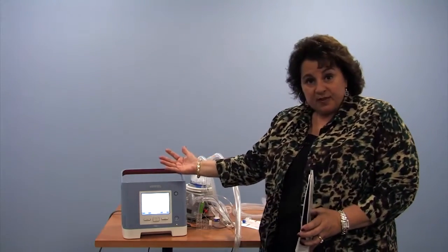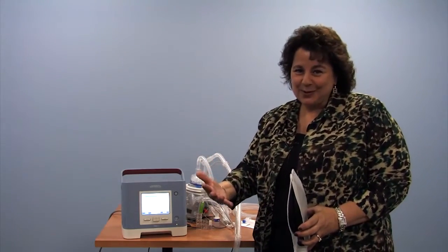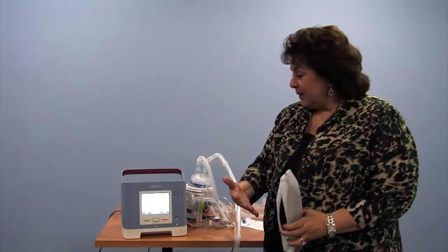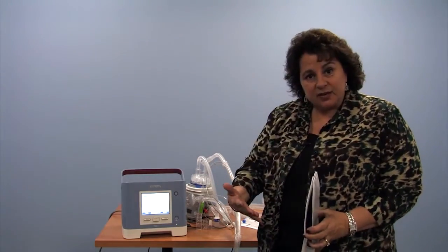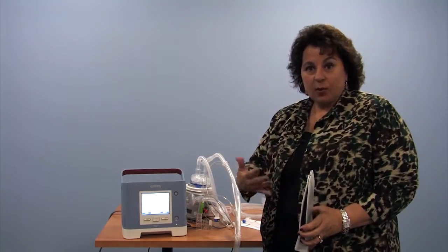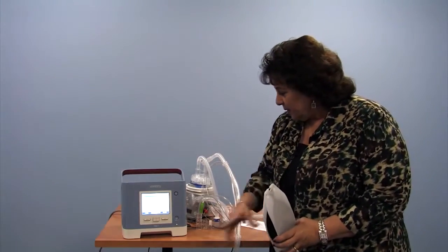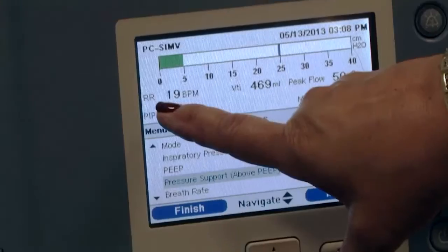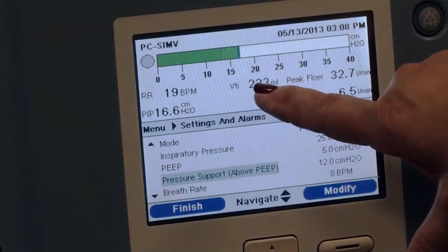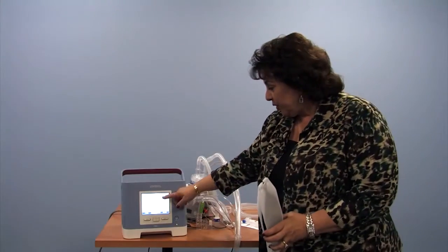How did we come up with these numbers? Well, obviously your child was on a ventilator before they went out into the community, so the hospital did determine what support was appropriate. And what the doctors in the hospital look at is the size of the breath and how efficiently that works for that child's particular size body frame. So we can see that the machine measures respiratory rate, 19 breaths a minute right now. Tidal volume, VTI, that's the tidal volume that the machine's delivering to your child.